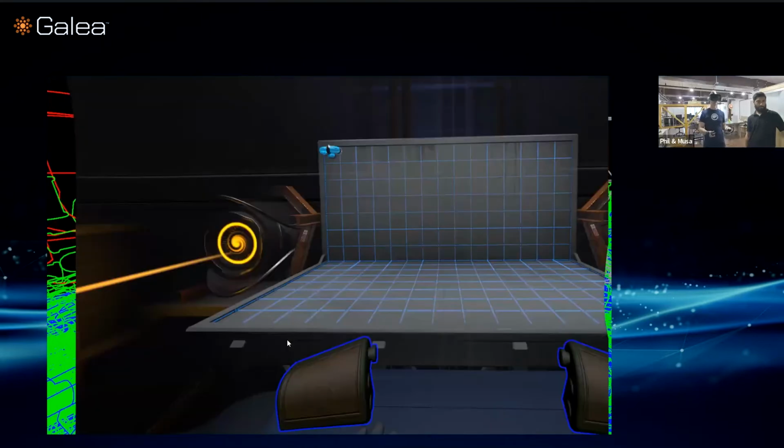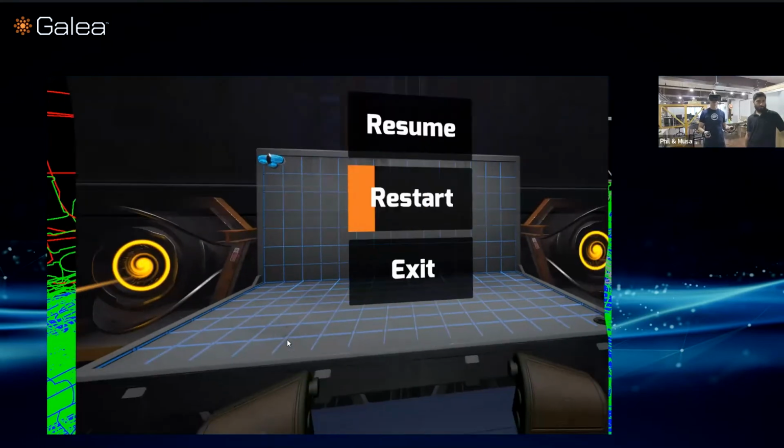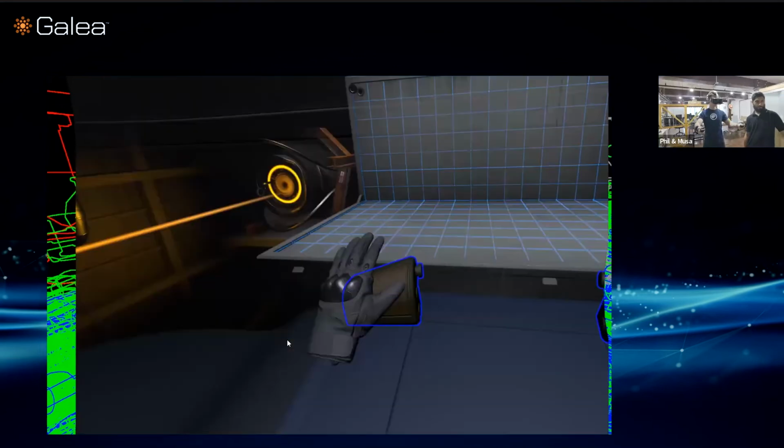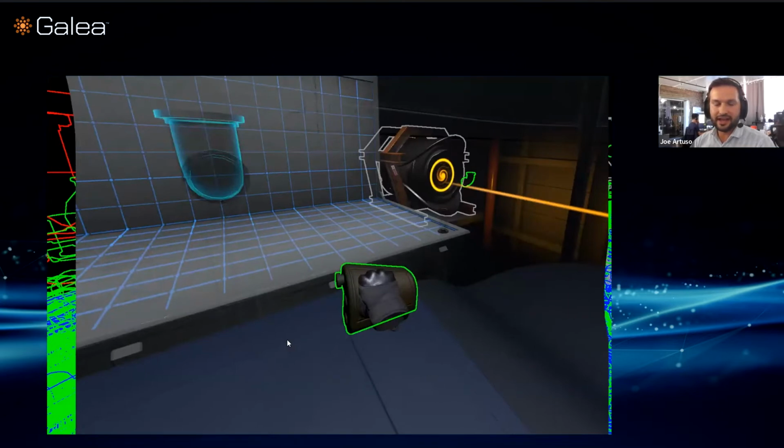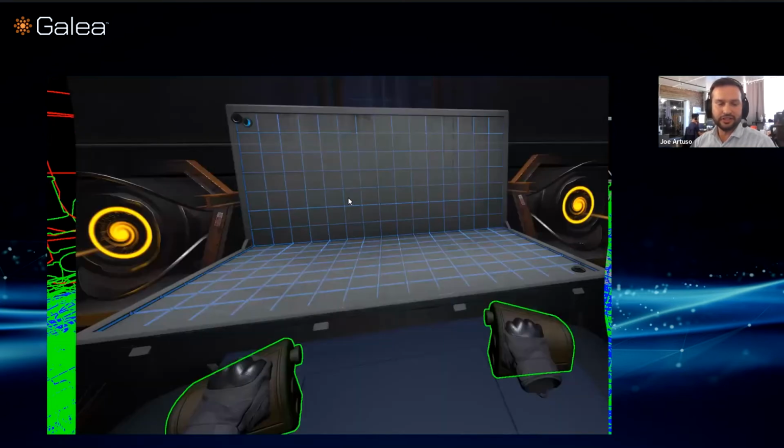I'm going to actually restart real fast and give you guys an idea of how all of this works. Musa, could you try maybe just refreshing the screen share quick? Because the video comes through Zoom plus VR view sharing, there seems to be some video throttling that Zoom does to the screen share.